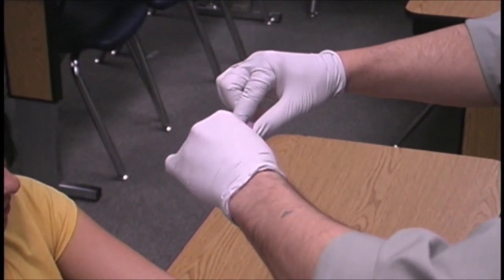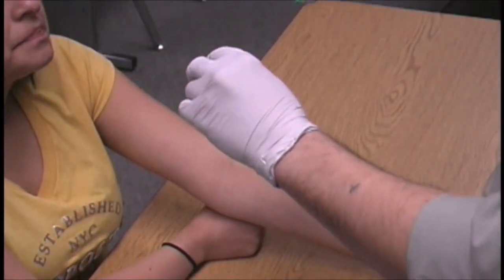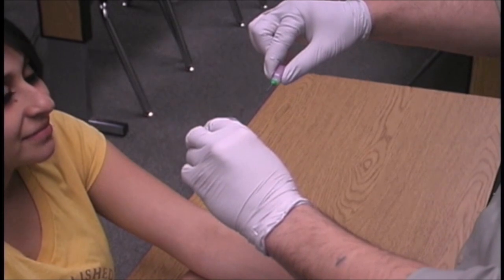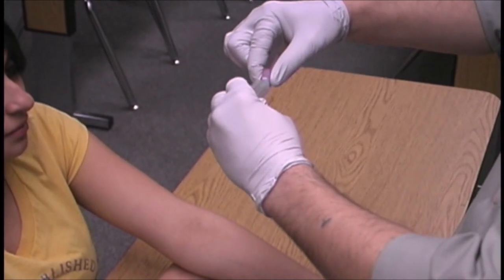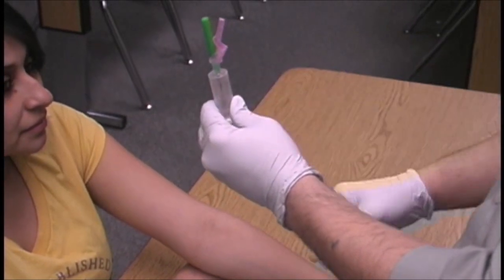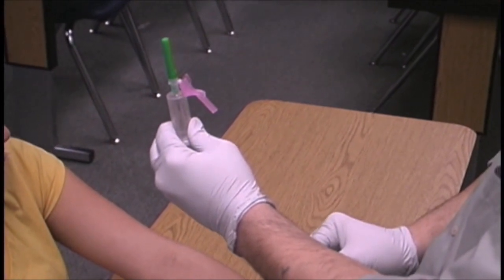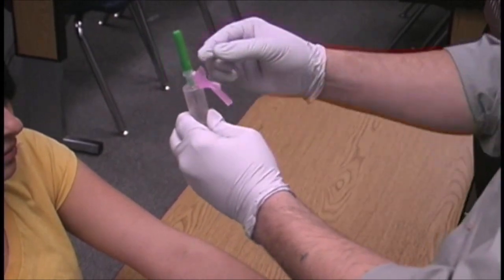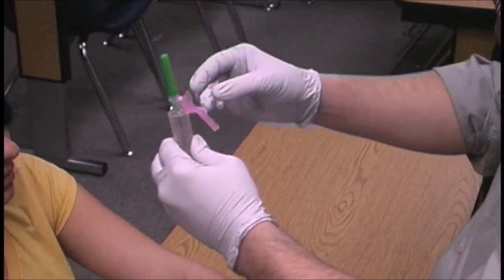He's going to lift the cap gently off and place it down. He picks up his vacutainer holder — notice he's not going to touch the needle because it is sterile. He inserts the vacutainer needle into the vacutainer holder and twists it slightly, then rotates it to an upward position. He pulls down on the OSHA-approved safety device, which can lift the cap slightly, so he reaches up with his thumb and middle finger to gently reseat the cap by pushing it down.